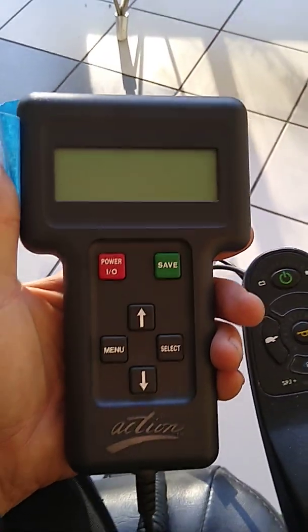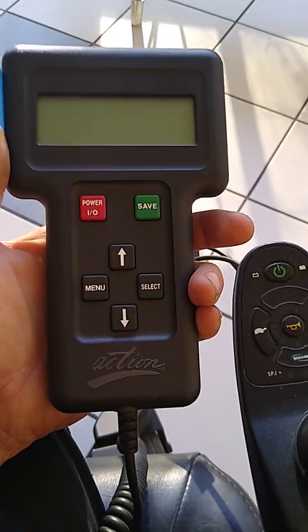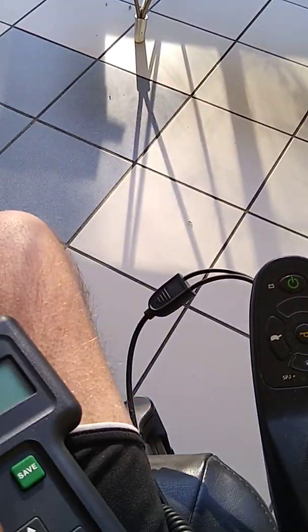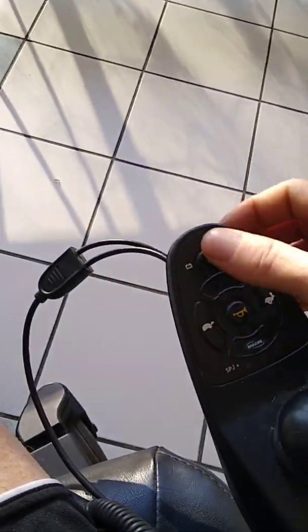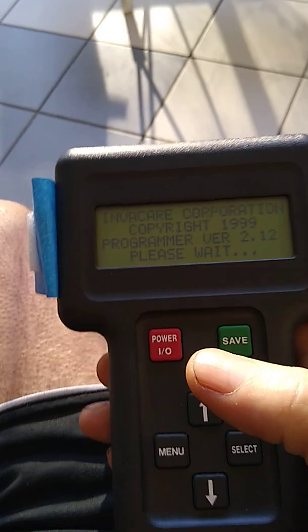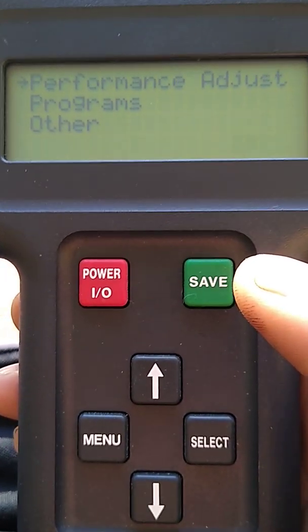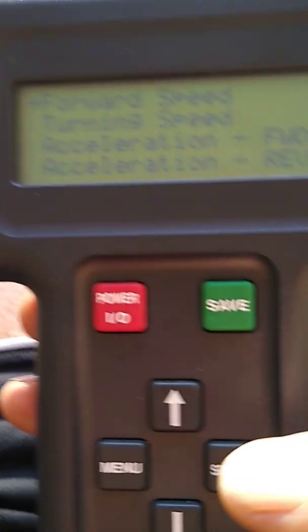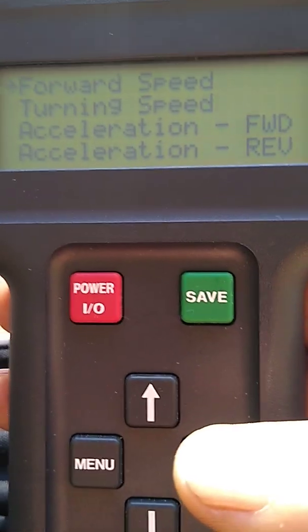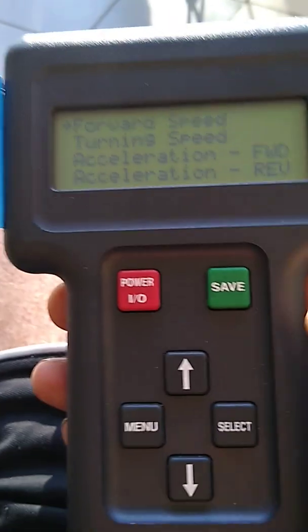Anyone who tells you that has an agenda, because what you can achieve with this little programmer is mind-boggling. I'm going to show you how it works — plug it into the joystick, turn it on, it powers up, and right at the top you get 'Performance Adjust.' Select that and here are your settings.